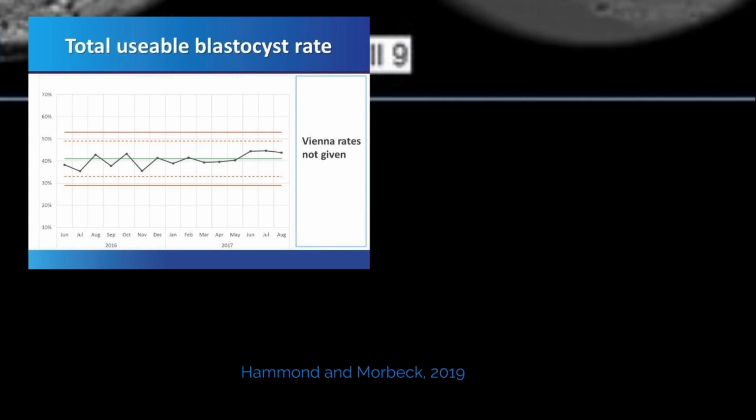But it was about January, February where we started to be a little concerned because our pregnancy rates were lower. Like, well, what could it be? What are the different things that changed? Well, we knew we changed the culture media, and that was something that was on our mind, but we had to look through all the different things. But about this time was when the early release of the Vienna consensus paper came out, and admittedly, I then had to recognize that, wait, day 5 blastocyst rate could be quite valuable. And so let's take a look at that.